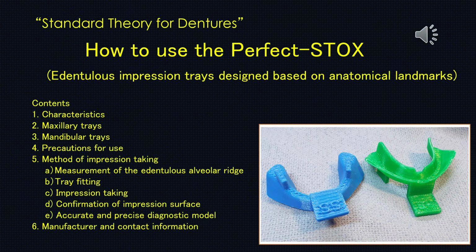Standard theory for dentures. I am Sotokawa, a dentist practicing in Morioka City, Japan. This topic covers how to use the perfect STOX.